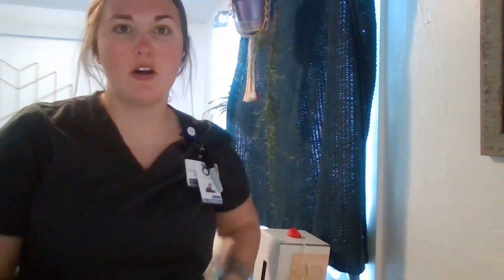Hi, my name is Alessandra Bice and I will be doing the blood administration skills video today. I'm going to start by entering my patient's room and identifying myself by saying hi, my name is Ali, I'm going to be the nurse. I am then going to verify my patient using two patient identifiers and shut the door and the curtain to provide privacy.